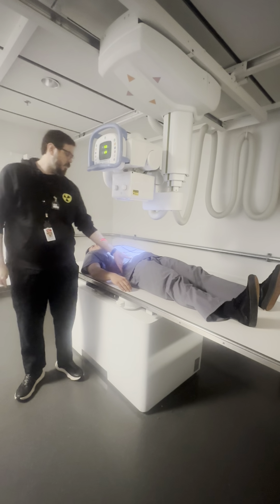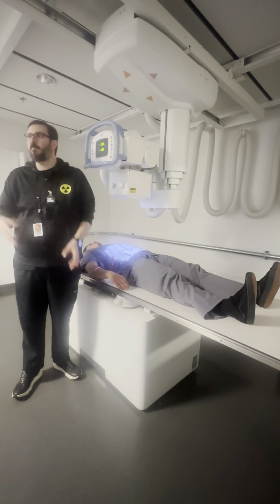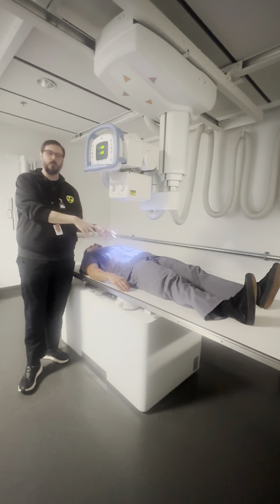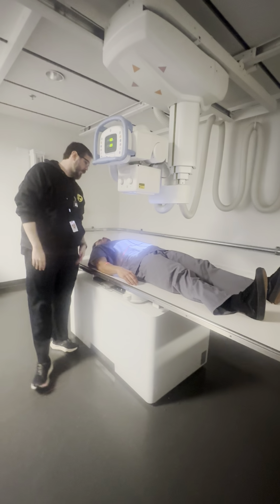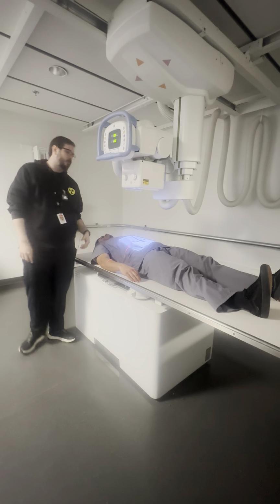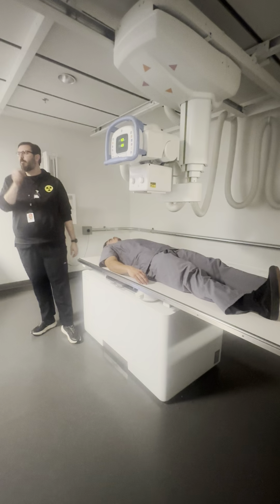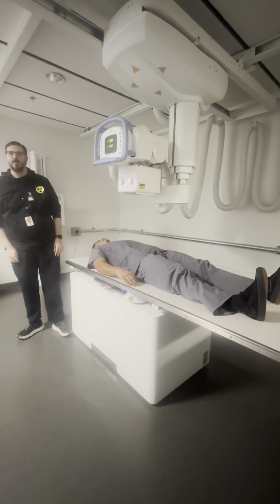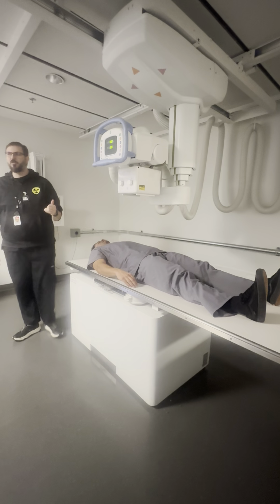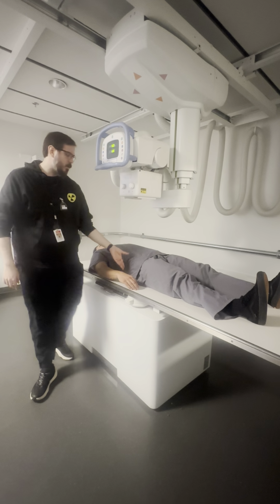The other way you can do it is you can find the crest and go up 2 inches. It's up to you which way you want to get there, as long as you get to that spot, right? Then you go straight down the mid-sagittal plane, so we can fit everything side to side. Your patient takes a drink, and then you're going to put 0-minute film, right? This is your initial shot, and it's going to be high. When you go to do your delayed shot, you're going to slide down to the iliac crest.